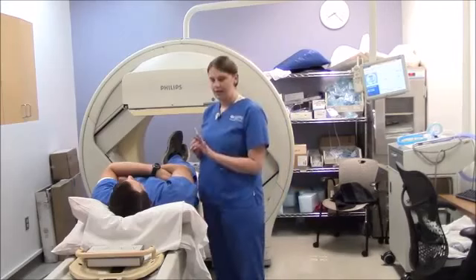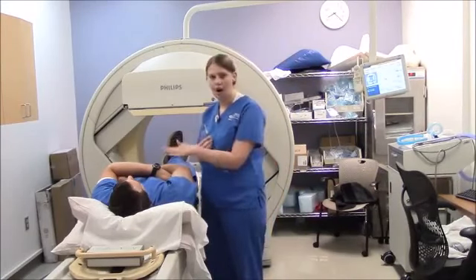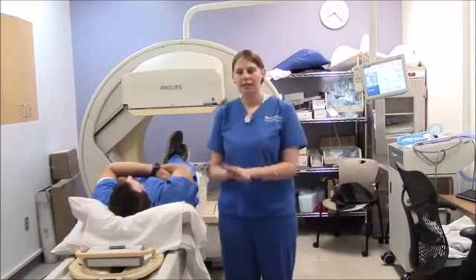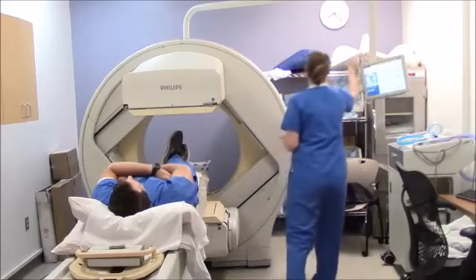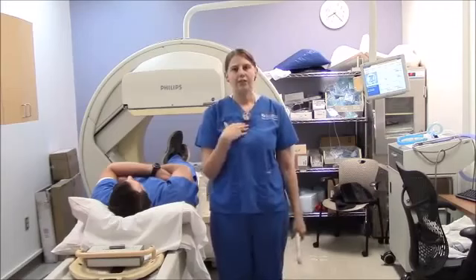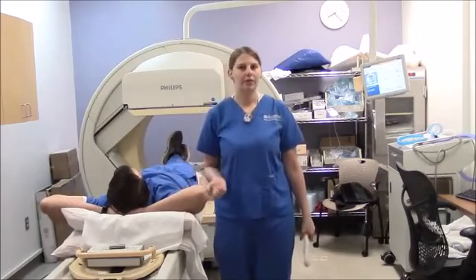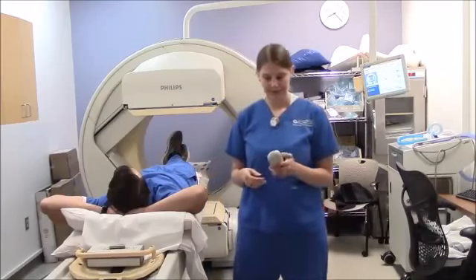You'll inject it through a butterfly needle or an existing IV line in the arm or hand, whatever's accessible. After the patient is injected, you can move right into the imaging portion of the test. To get a good view of the lungs, you will want the patient's arms out of the way. Will you please raise your arms? Get them in a position where it will be comfortable for them to hold their arms like this for about 15 minutes.